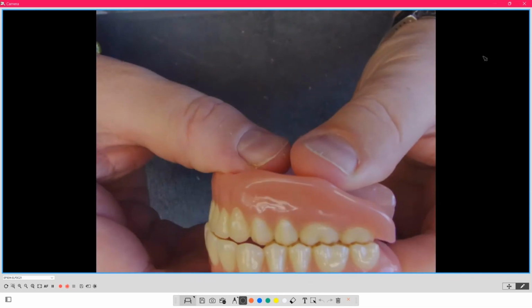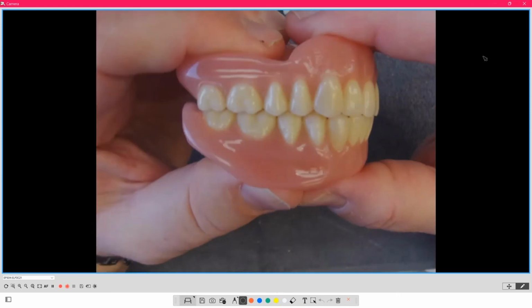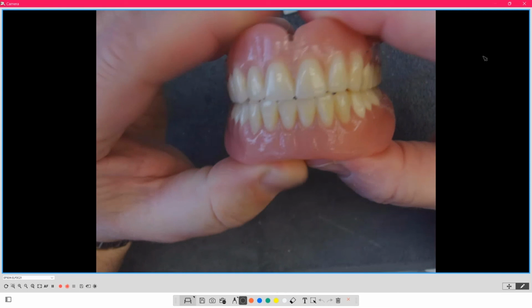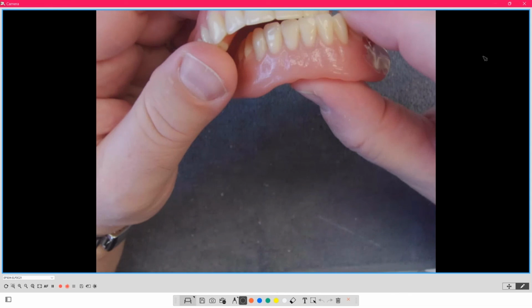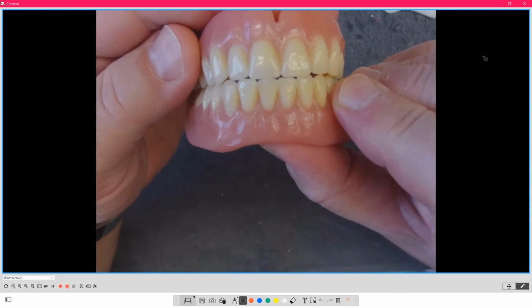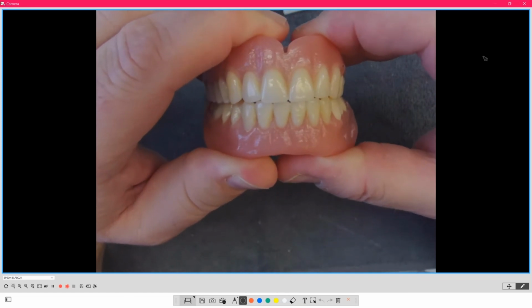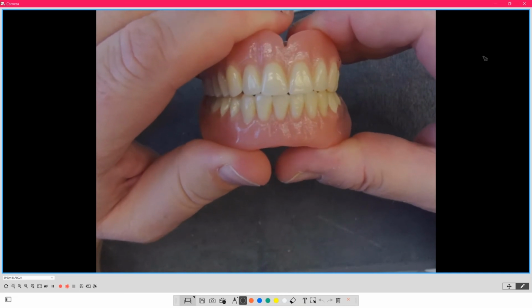When we set them up, we're typically, geez Mark, you're upside down. It looks like this, so it's quite a tight bite. We're looking for that tight groove. And now these teeth have no freedom in Centric, but they work in balance. So when I go through this motion, the teeth are working and balancing. They're milling the food, but in Centric, I cannot wiggle the denture. So when you do this, it'll go immediately up and go into the working and balancing. There's no freedom in that Centric there.